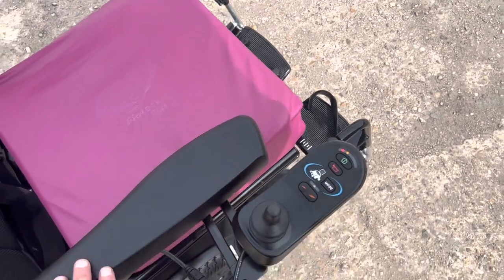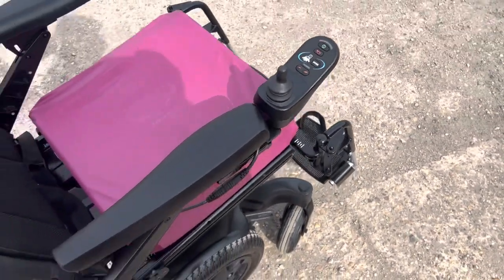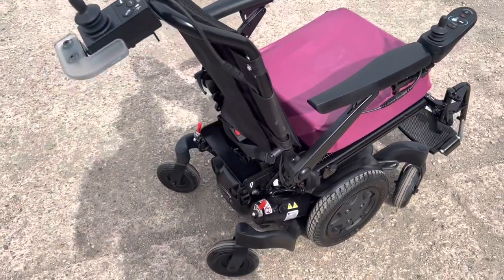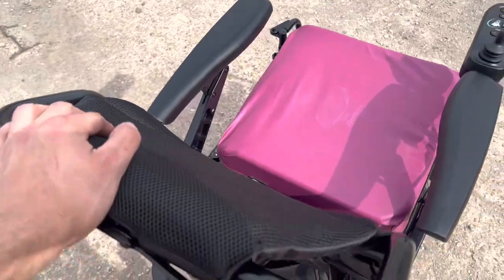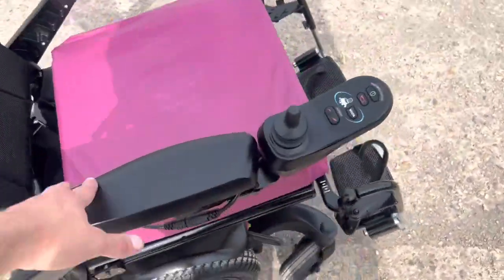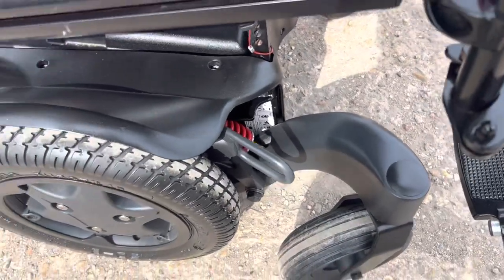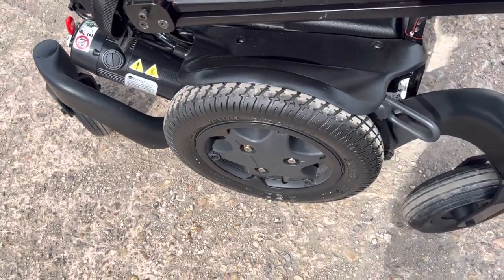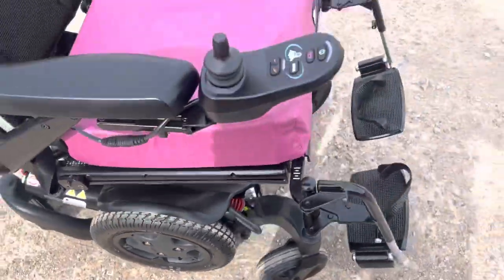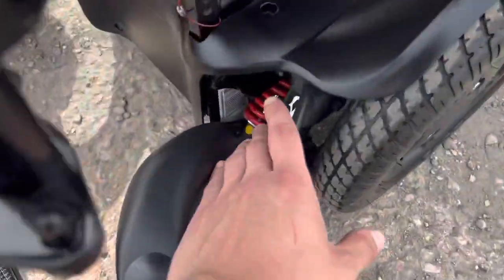The joystick here can swivel round and magnetize back in place. Overall a very handy chair. The width of the back can also be adjusted. There's suspension down there, and the tires don't need pumping up — they're solid but still have a slight bit of cushion to dampen any bumps, plus you've got the suspension as well.